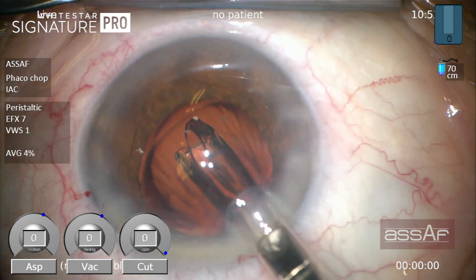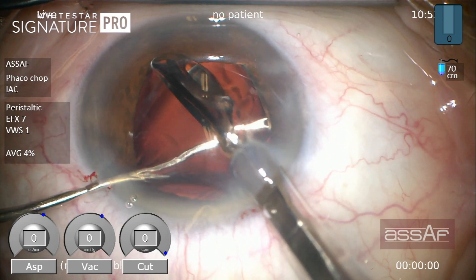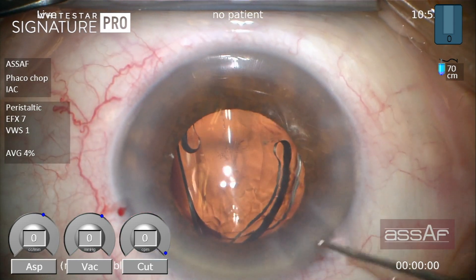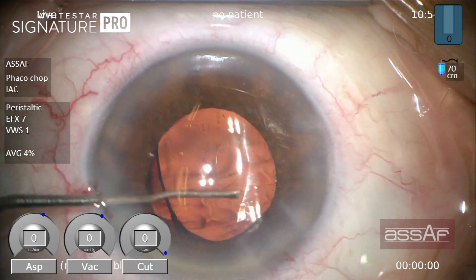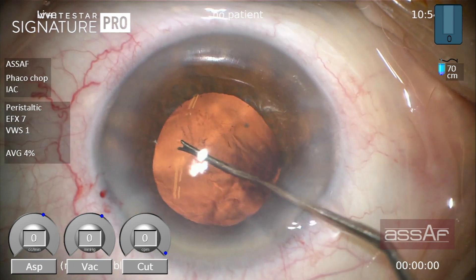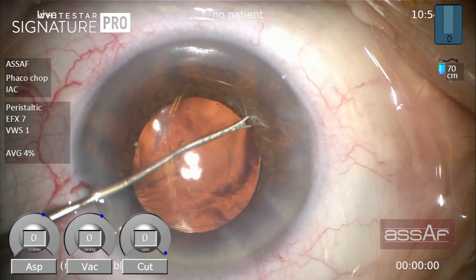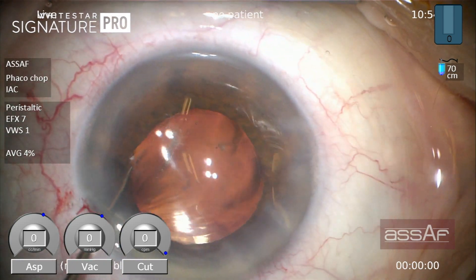The break extended from one equator to the other. I'm planning to place the lens inside the capsular bag or inside the remaining capsular fornices, taking advantage of the slow unfolding of the hydrophobic acrylic single-piece IOL — we have enough time to manipulate the lens so the haptics unfold at the area of maximum capsular support. Here I'm confirming that the haptics have unfolded on the area of maximum capsular support from the posterior capsule, and that the lens has been completely implanted inside the remaining lens capsule.